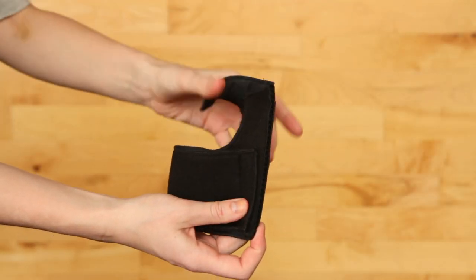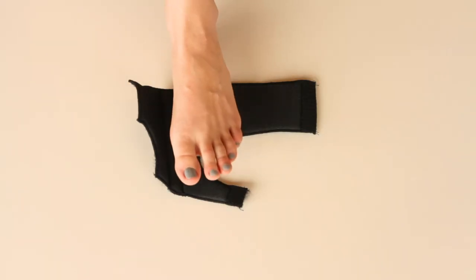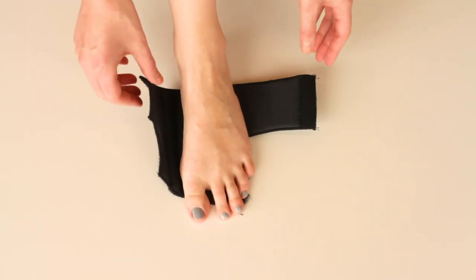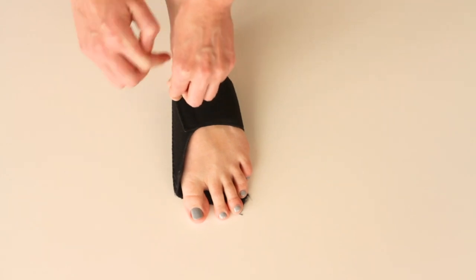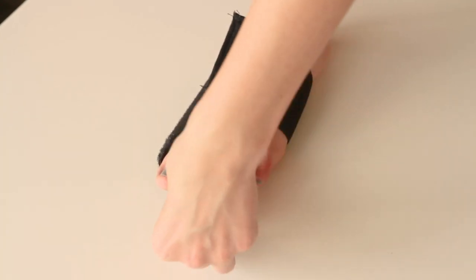To apply this splint, undo all of the velcro closures and remove the velcro strip. Place your foot over the bunion splint. Wrap it snugly around your foot arch and secure. Attach the velcro strip to the toe strap.